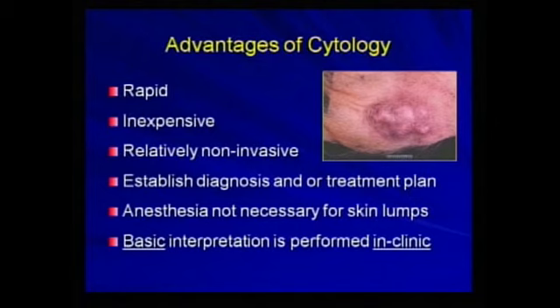This lecture is primarily intended for anatomic pathologists. As I said before, I'm not a clinical pathologist, but my job today requires examining quite a few cytologic specimens each day. I'd say today about 60, maybe 70% of what we see is cytology.